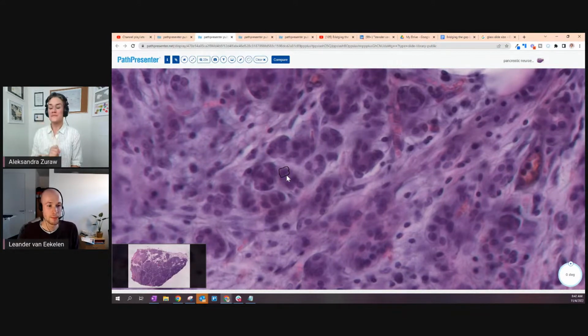So that's object detection. Here I want to talk a little bit about this bounding box. We want to detect them, and you obviously see that I try to make a square. It's not exactly the boundary, it's just showing me where it is and those coordinates. So let's structure it that way. We're going to be talking about the different tasks, like now we're talking object detection. I will try to do some drawings for you, based on what you're explaining. So if you're explaining well, I should do good drawings. And then let's talk immediately about applications that come to your mind and that come to my mind, where we want to use this instead, in contrast to other approaches.